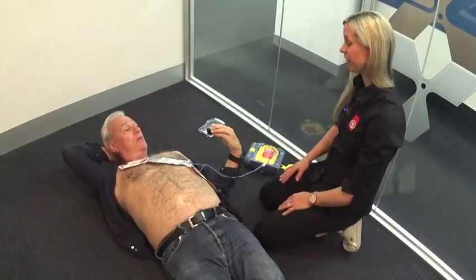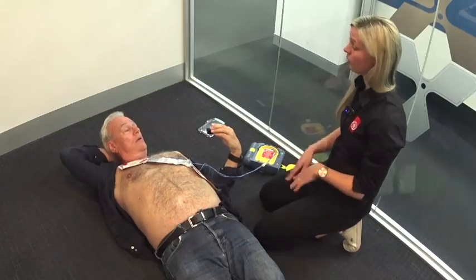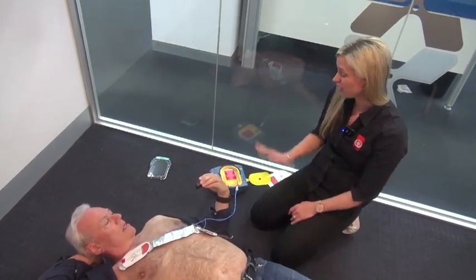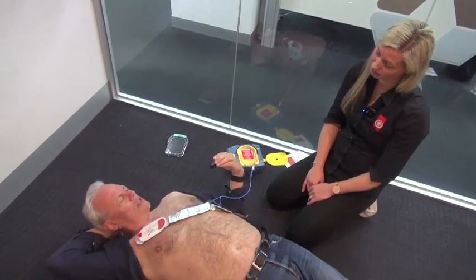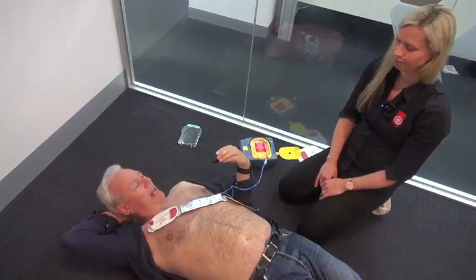That's right — all defibrillators are designed so that they'll all talk to you, they'll work the same way: pads on the body in the same manner, one up here, one down there, and follow the instructions. Anyone can use a defibrillator.